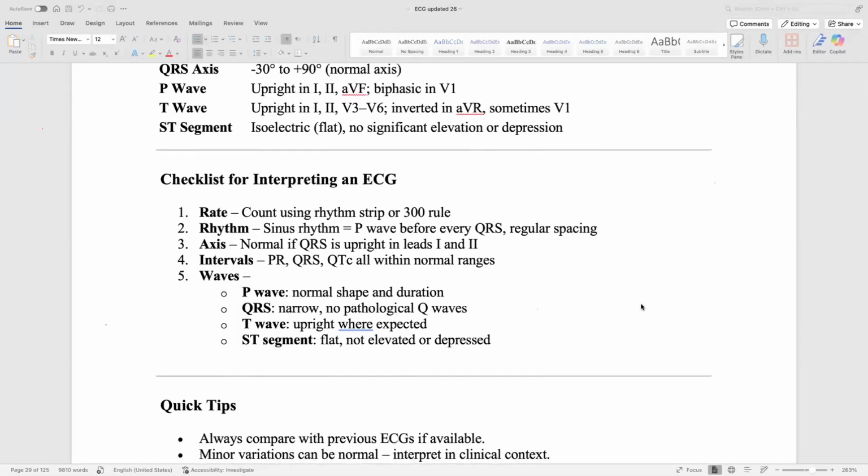Remember, if you don't go systematically, even if you're a master, if you have no knowledge of the shape and the specificities of the leads, you can miss a lot of valuable information. Okay, so systematic.